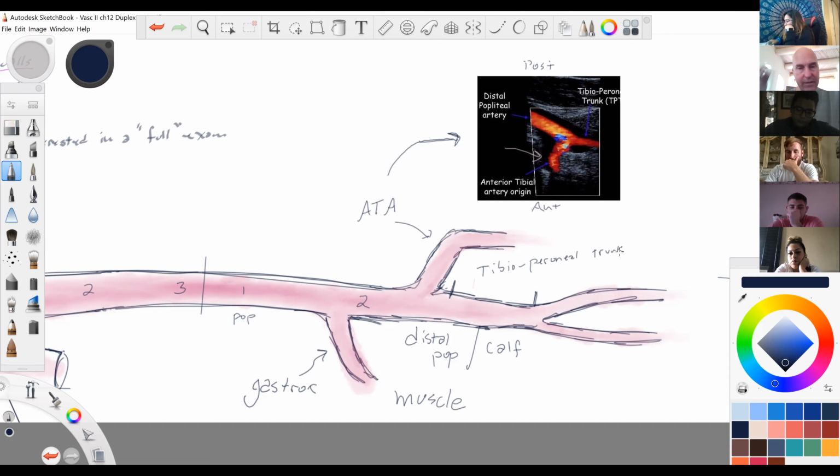You have to try. With the DVT studies, I kind of say, look, if you miss something, and you go down a little farther, and the blood flows good there, and the blood flows good here, chances of something being wrong in between are kind of low. Unfortunately, with peripheral arterial disease, you really need to be trying your best to see everything. But if you can get that, that's awesome.